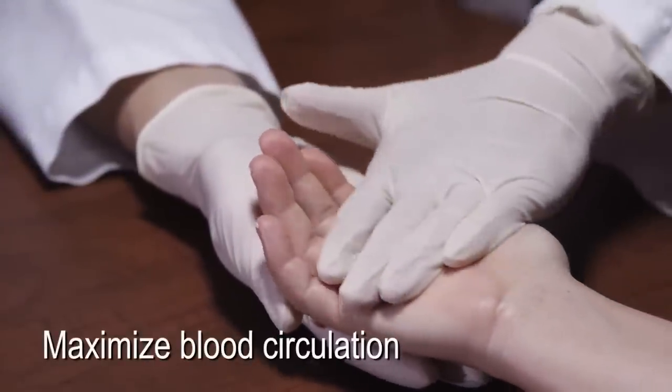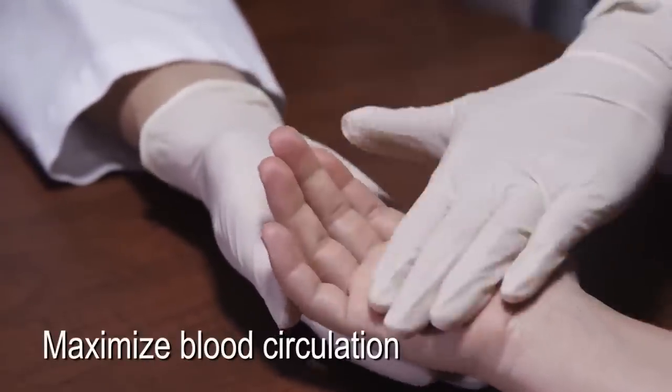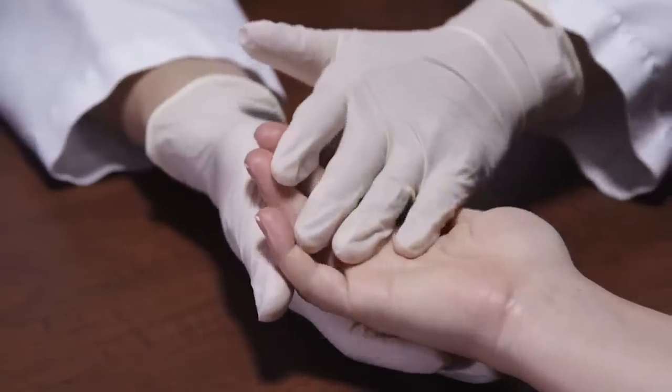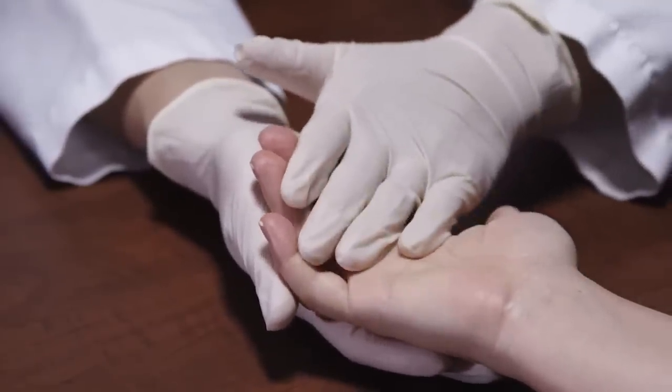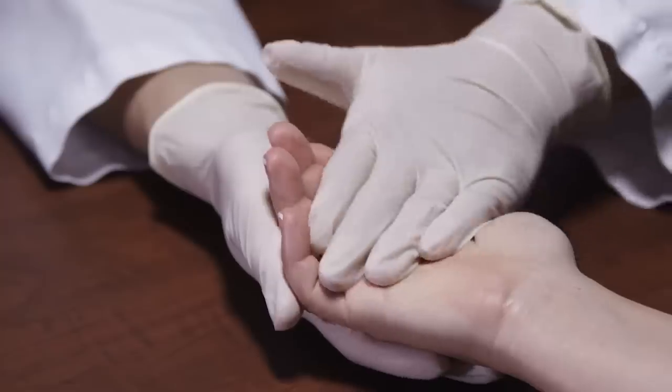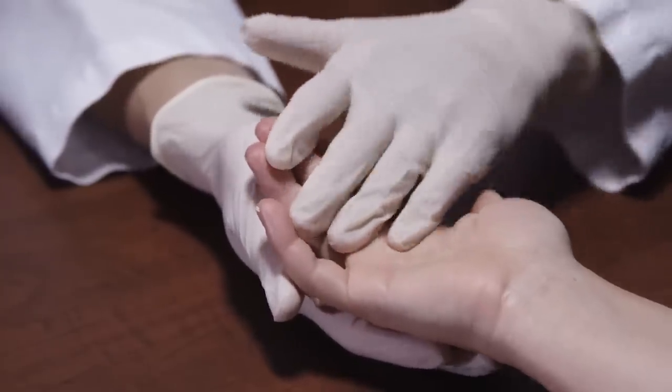Make sure that the patient's hand is warm and relaxed before collecting the capillary blood specimen. Wash the hand in warm water for a couple of minutes to improve blood circulation and remove any lotion or cream if necessary.